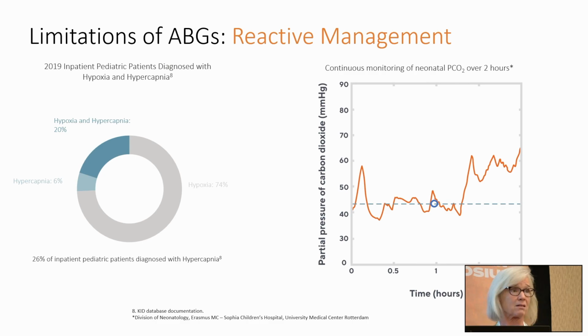You can say, oh, that CO2 went up. That's not normal. I'm going to go in there and figure out what's wrong. And I love that. As a respiratory therapist, it's like a superpower. Oh, I'm going to go in there and get that CO2 back down before we have to do another blood gas or a vent change. Sometimes their conditions change. Their lungs have gotten worse, and so you do need to go do a vent change. But you want to be able to get in there and give it a shot first before you lean on vent changes.